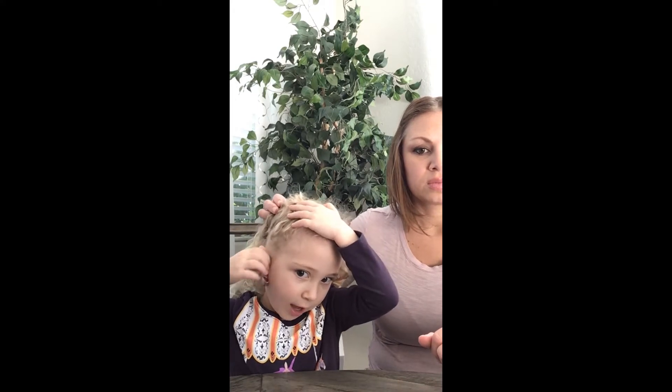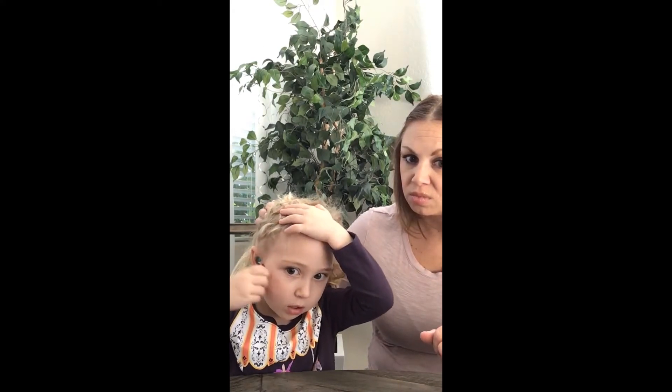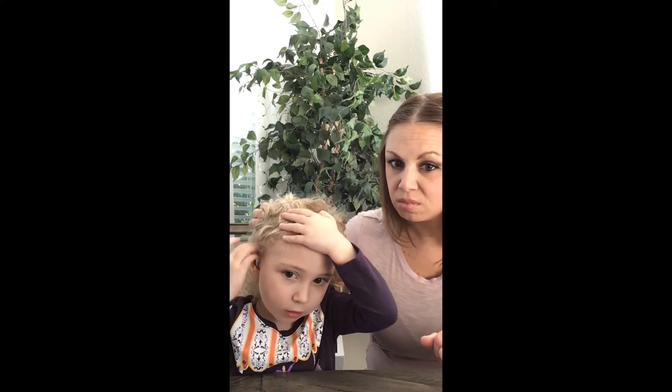I'll show you how to put it in. First, you take that, you swing, and then you tuck the ear mold in, you swing the processor around, and then you pull the hair out. Good job.